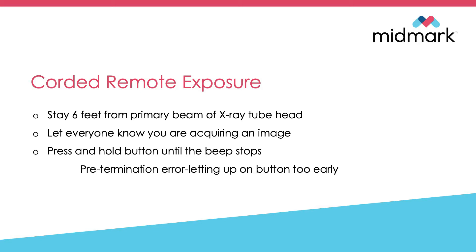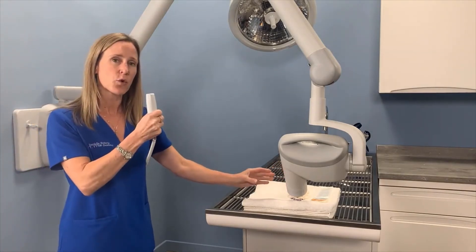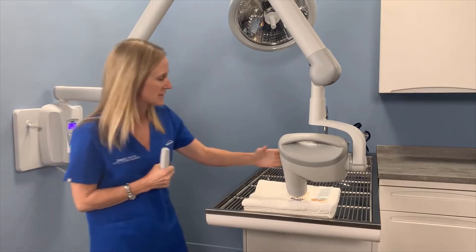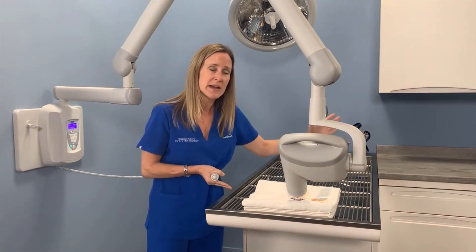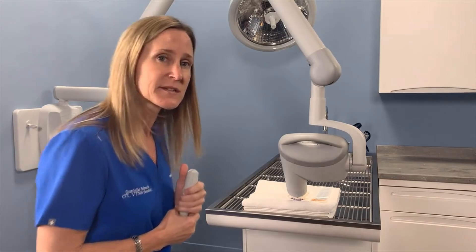We also want to let everyone know when we are acquiring an image. We're going to press and hold the button until the beep stops. Once you've positioned your sensor and tube head, take this corded remote and get six feet from behind the primary beam of the x-ray tube head. Anyone in front of the beam needs to step six feet back or get behind the primary beam.